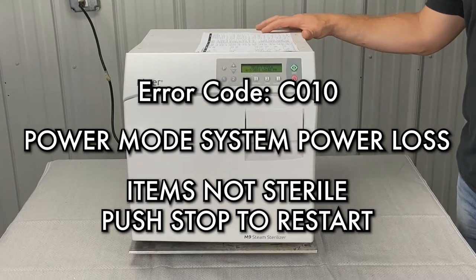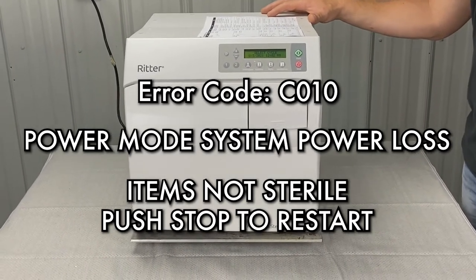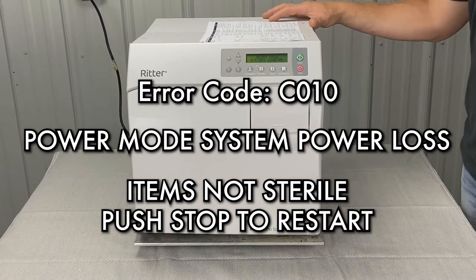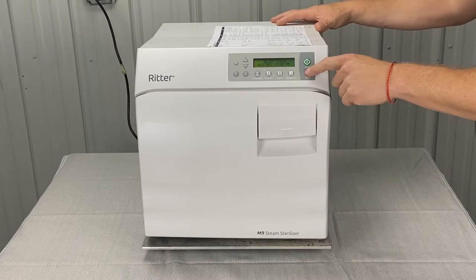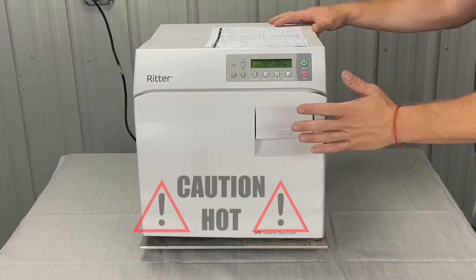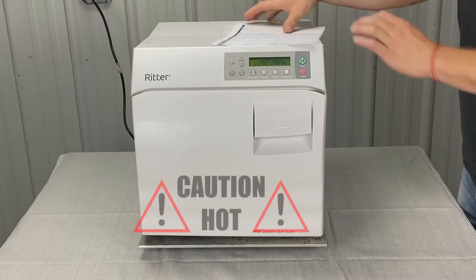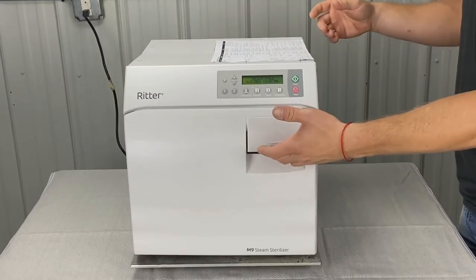Error C010 is power mode, system power loss, items not sterile — push stop to restart. We don't have an error on the screen here, but we're going to hit stop to restart and let the error clear if it can. Also, if it's hot and there's pressure inside, you're going to have to pull the pressure relief valve to release the pressure, then open the door.